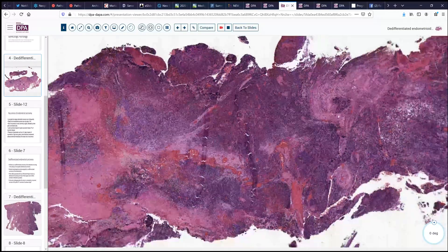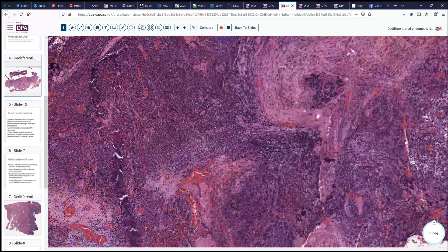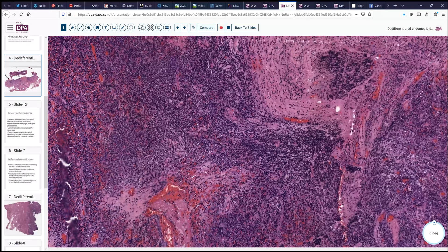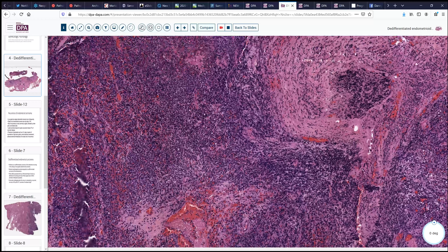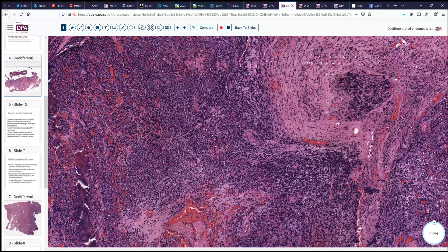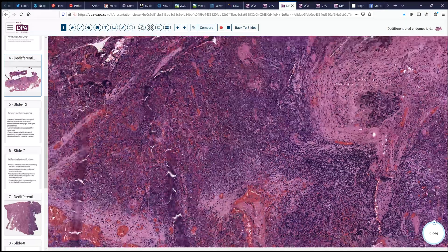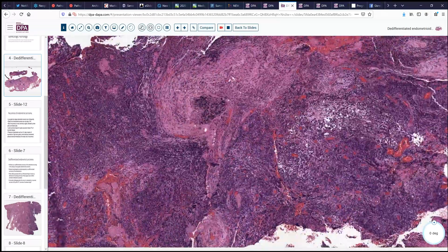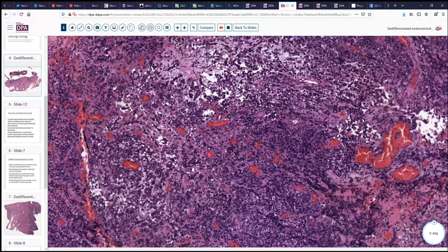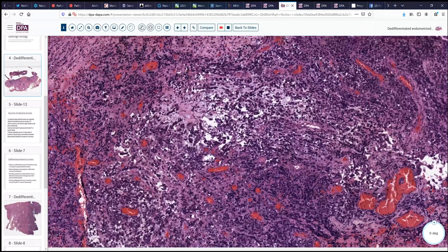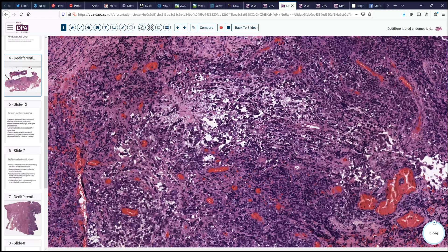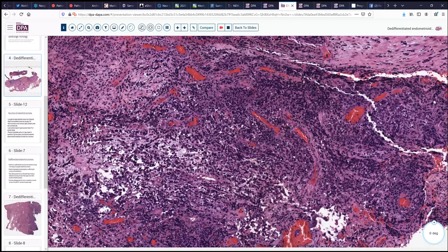This is a bit of an unusual pattern. Certainly low-grade endometrial cancers do not recur with great frequency, especially at seven years after the initial tumor, so we'll need some additional supporting evidence to sort that out. Also, there's a little bit of spindly stroma, and we'd want to rule out other things like lymphoma or other high-grade small blue cell tumors that could be associated with this kind of scenario.